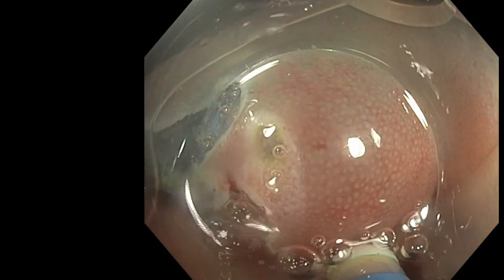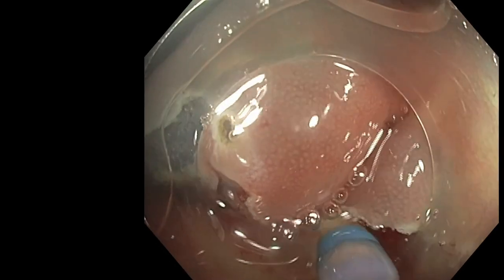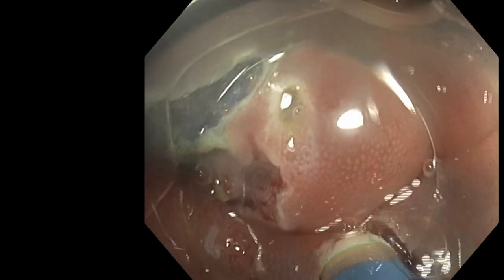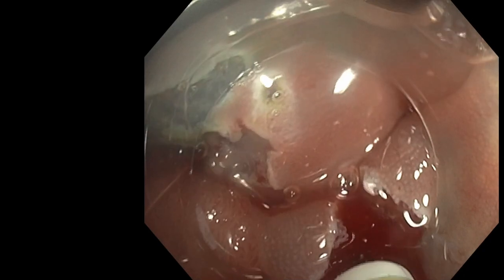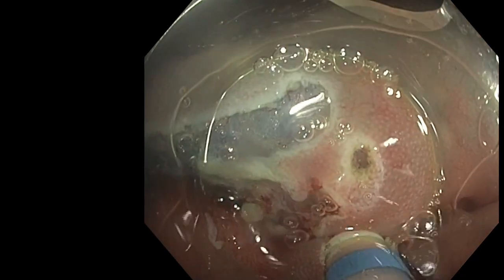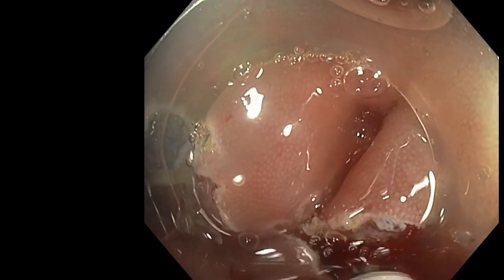and for having a large margin to reduce the vascular density, because under the lesion you have more vessels, so it's more difficult. So I like to have more margin, but in this case I wanted to find a compromise between margins and trying to avoid removing a second diverticula on the right where there was no lesion.